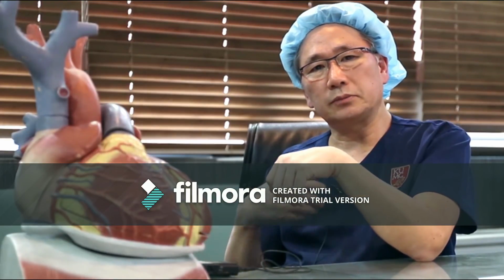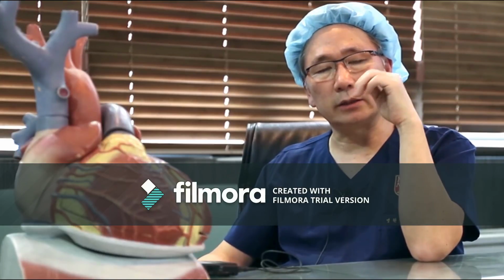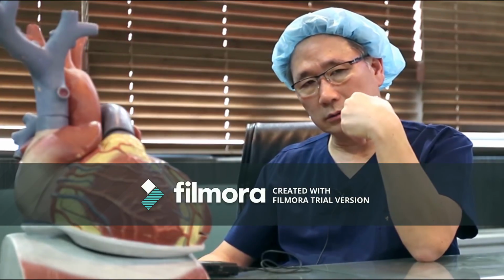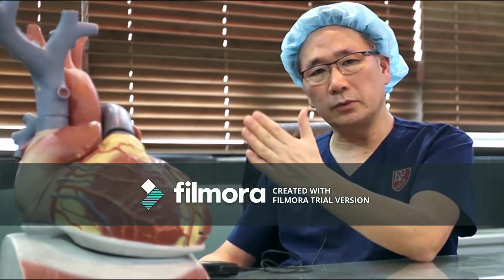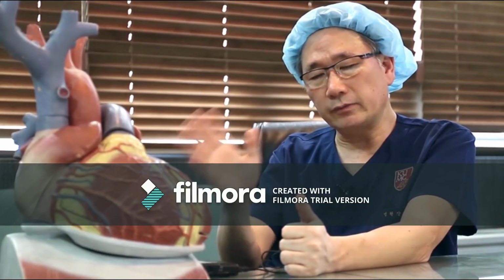But if it is right in the left atrium, the contrast goes anterior.